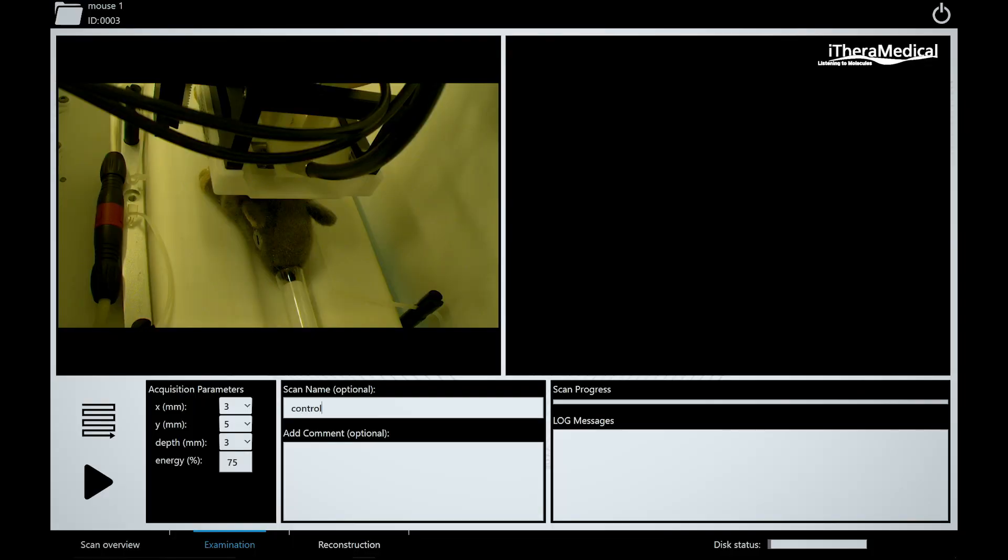The scan process begins by naming the next scan. Scan quality is assessed by performing a fast scan, which allows proper positioning and coupling to be confirmed.